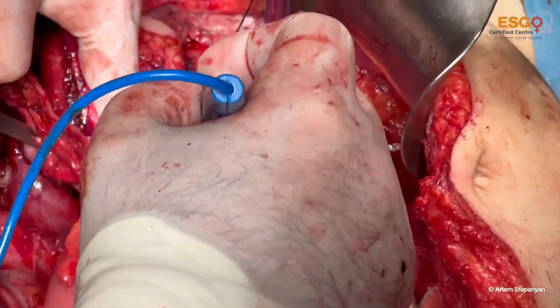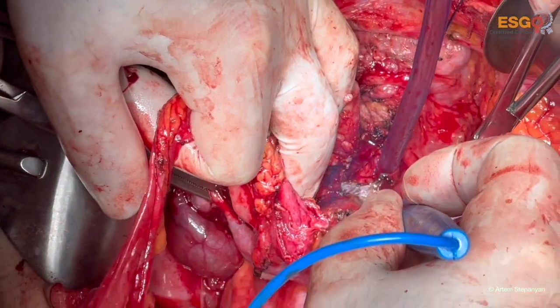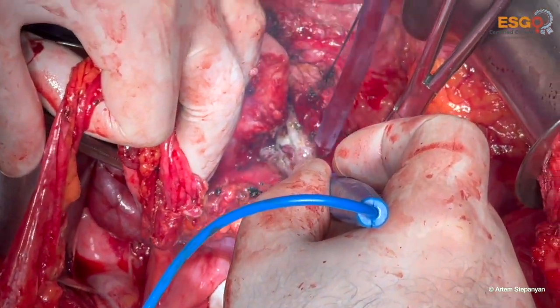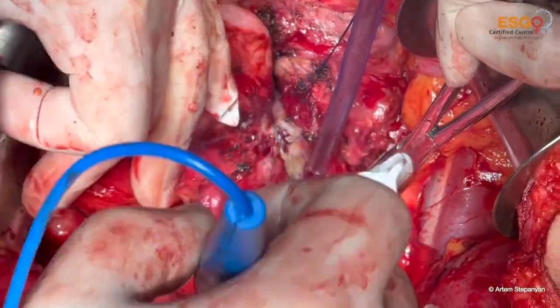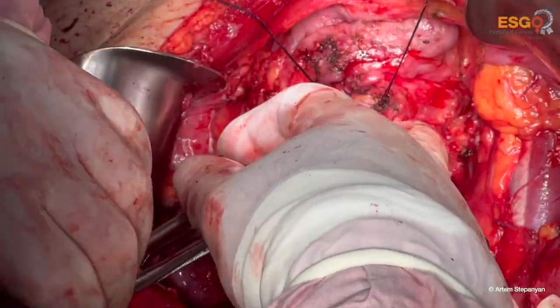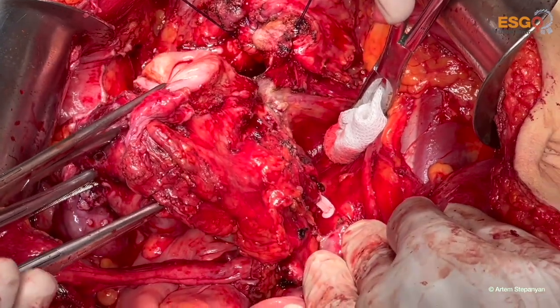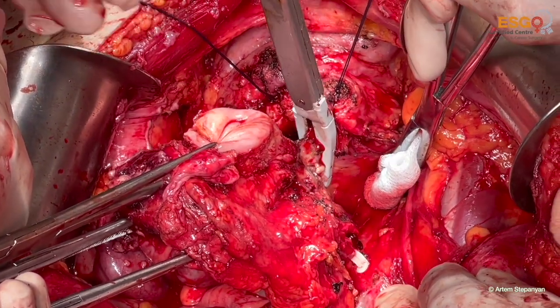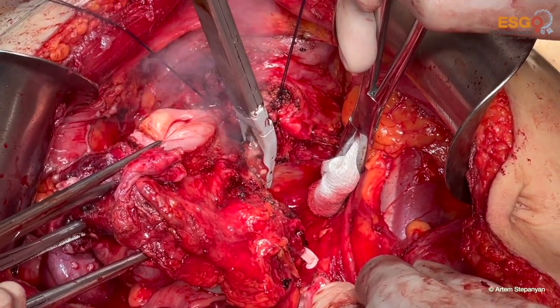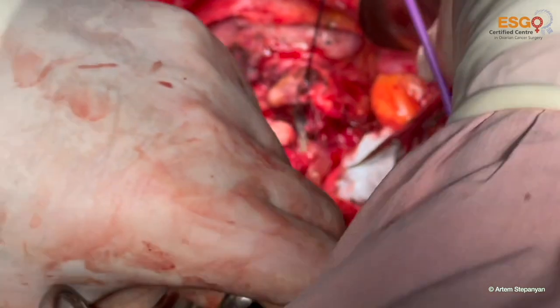This is the ureter. Again, I'm cutting the right uterosacral ligament, going towards the rectum, towards the mesorectal fascia, and so detaching the Douglas's pouch peritoneum from the proximal rectum. This is the uterosacral right one, cut by ligature.